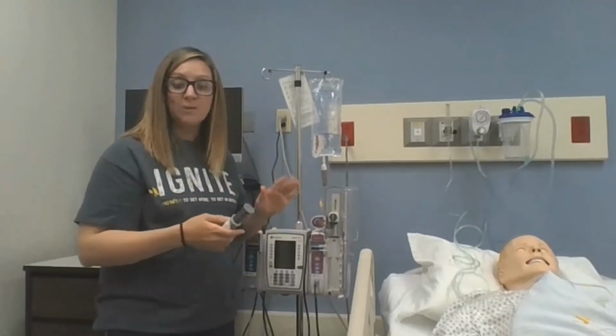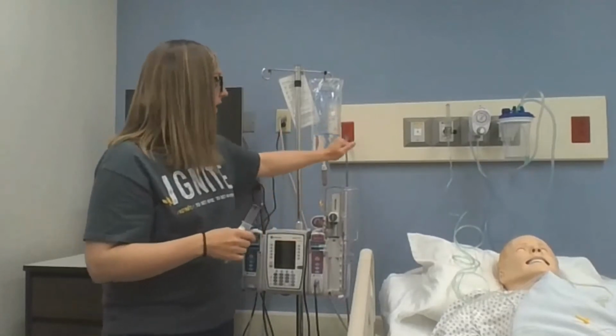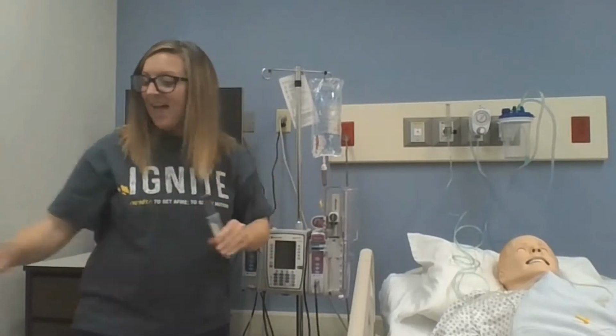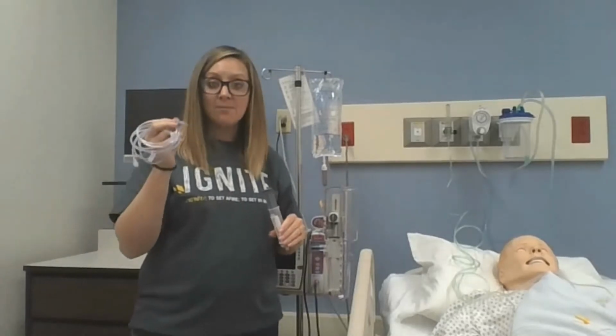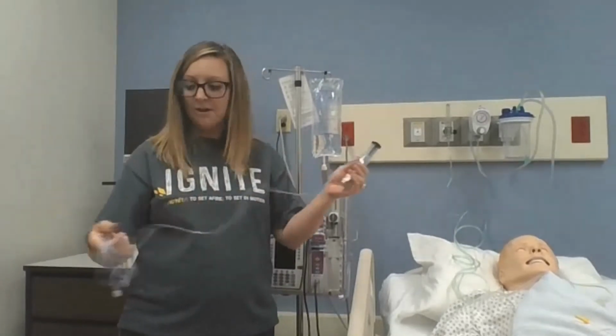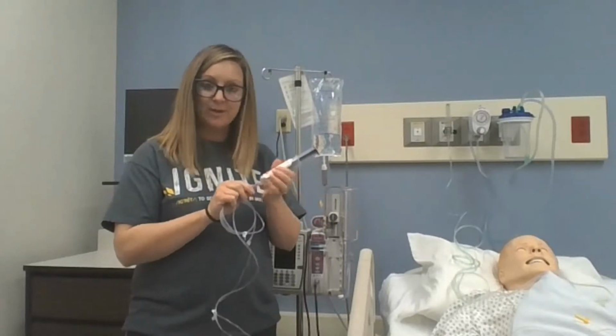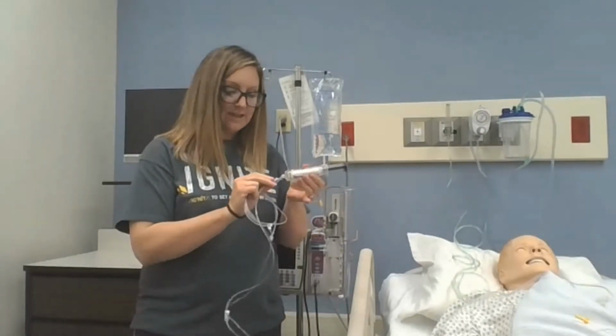So you are going to make sure that you've got your vital sign machine, you've got your O2, you've got your pump, your purple key, and of course your drug. And then you also need tubing, of course, to administer. You're going to get that from the CS room. It's a little bit different from our secondary tubing. You're going to attach it to the end of your syringe.